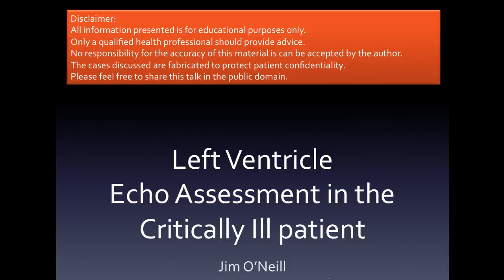The left ventricle, which is the easier ventricle to talk about, I think we'll all agree. Thank goodness I didn't have to talk about the right ventricle, because I really don't understand the right ventricle. There were a few issues we were going to discuss during this talk this morning: a bit on left ventricular function and semi-quantitative grading, a bit about ejection fraction. People get very hung up on ejection fraction.